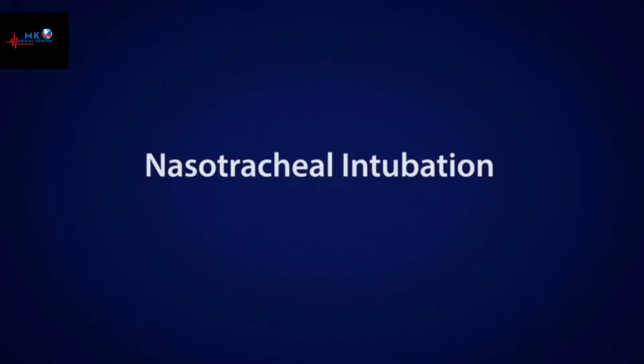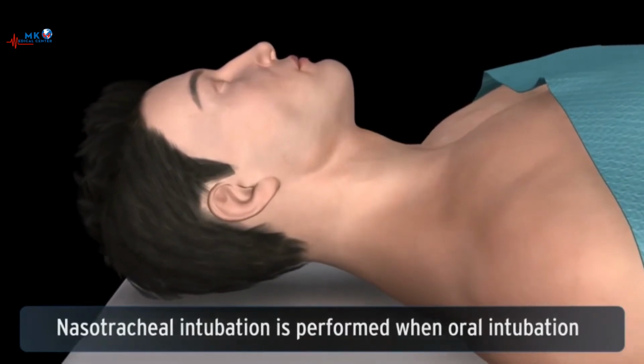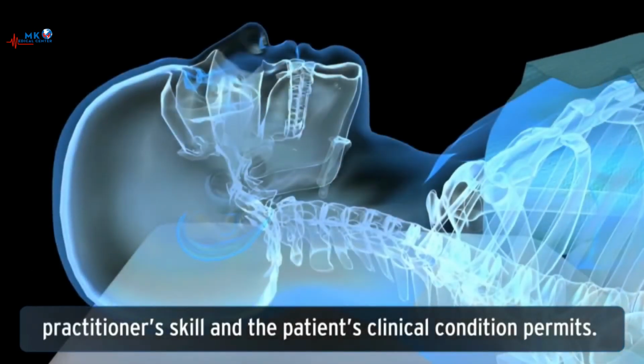Nasotracheal intubation. Nasotracheal intubation is performed when oral intubation is not appropriate or is contraindicated, and when the practitioner's skill and the patient's clinical condition permits.